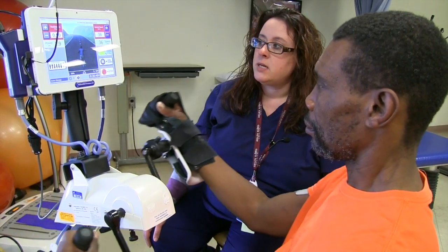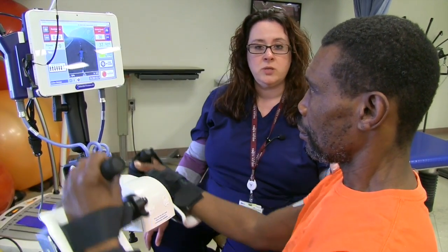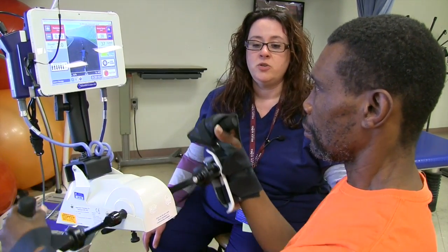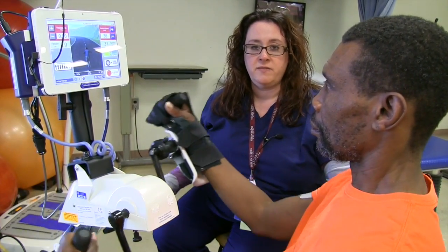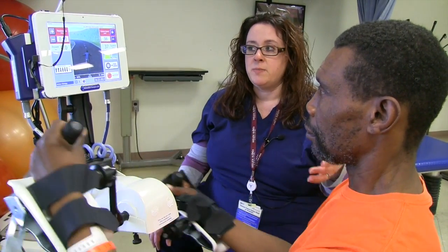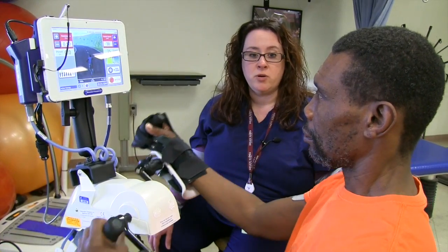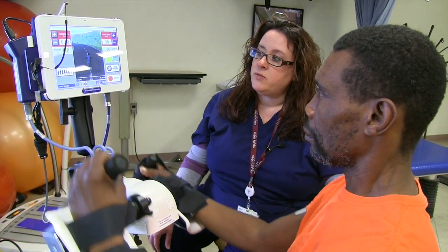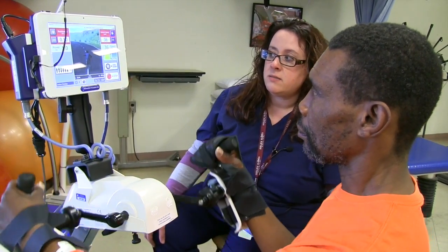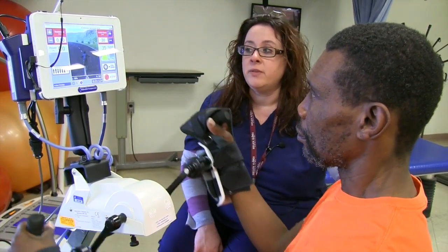You can use it for the legs, but I do most of the arms. In strokes, since usually it's one-sided and one side of the body is affected, we usually use one arm. But on spinal cord injuries, a lot of times it's likely that they'll be using both arms. But for today, for Joe, it's his right arm since the stroke affected his right side of his body.